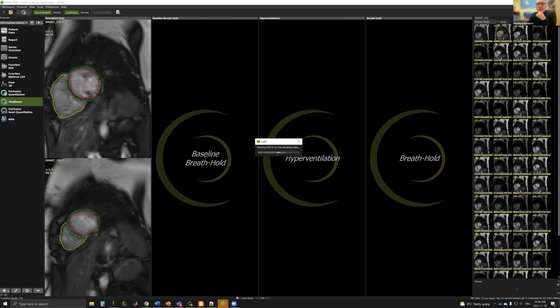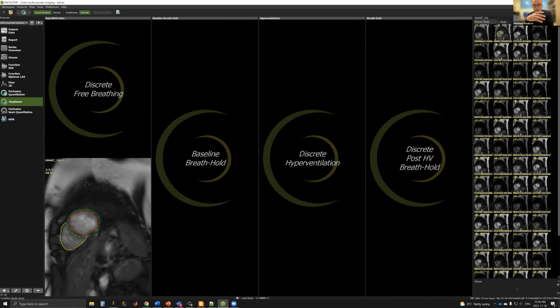Yeah, no, I wanted to just highlight what you said. This version now needs a manual input of the end of the hyperventilation, etc. This is very important. In the future, this hopefully will be automated, hopefully sometime soon. But in the first studies, where we did that manually, this was always a very important step. Because if you do not correctly identify the stages, of course, your values are not necessarily correct, and that's why this is quite important. This is one thing I wanted to stress.